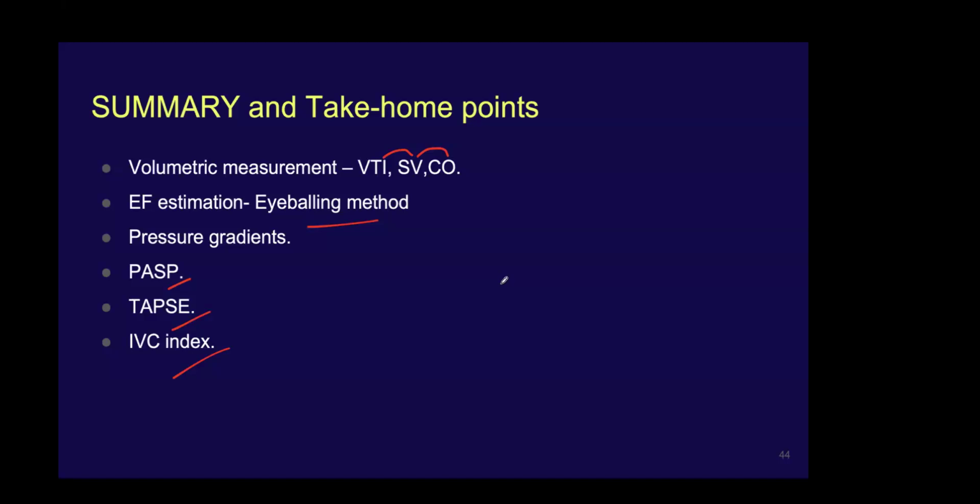That's excellent, Shiva. The one more thing I want to highlight is that pulmonary pressures, PASP, will be high in both acute and chronic conditions. It can be PE or it can be pulmonary hypertension per se. How to differentiate at the bedside is by using RV free wall thickness. If your RV free wall thickness is more than 5 mm, it might indicate that it's chronic. If you have to make an urgent decision at the bedside, such as doing a thrombolysis, based on the clinical picture, make sure that you measure the RV free wall. If RV free wall thickness is quite high, it indicates RV hypertrophy and that the condition is chronic.